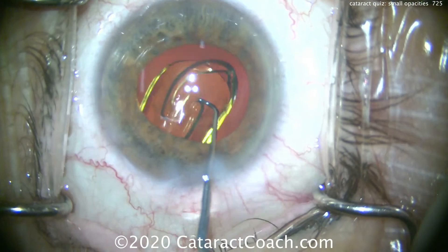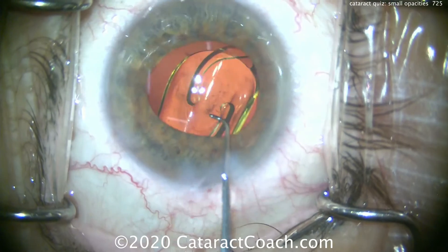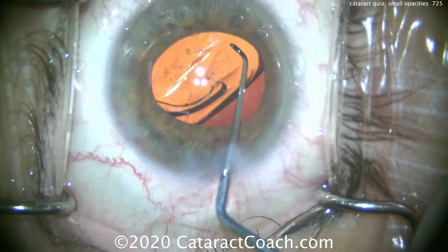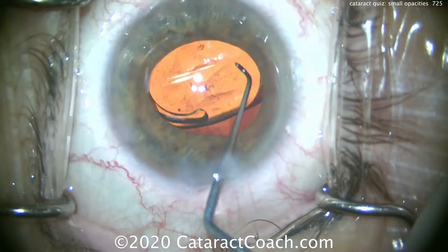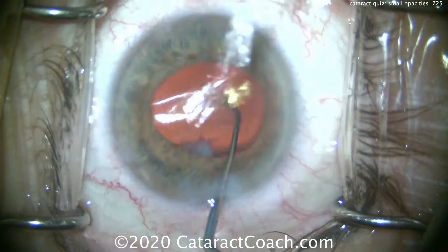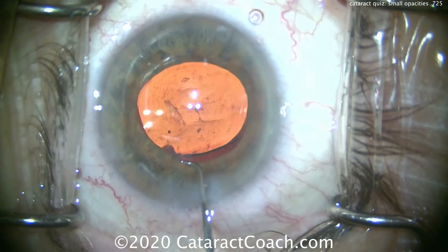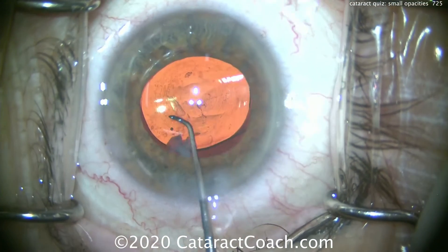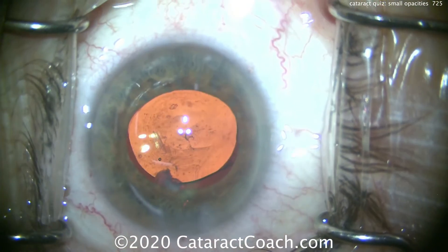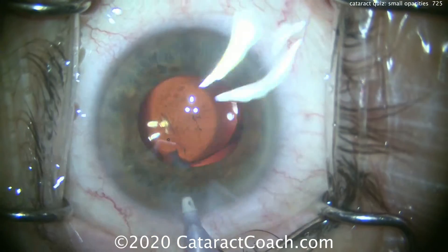There's a little bit of fluid in the anterior hyaloid face, but we don't have shallowing of the anterior chamber. It's not a lot of fluid — very, very little. And what's going to happen to those particles? They're going to absorb over time as the inflammatory process helps dissolve them.